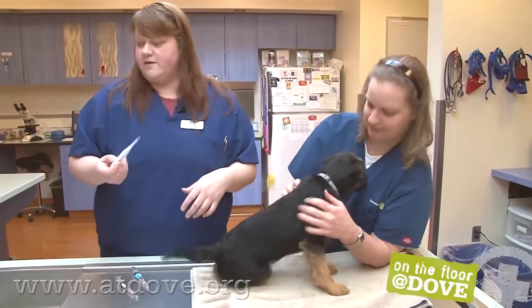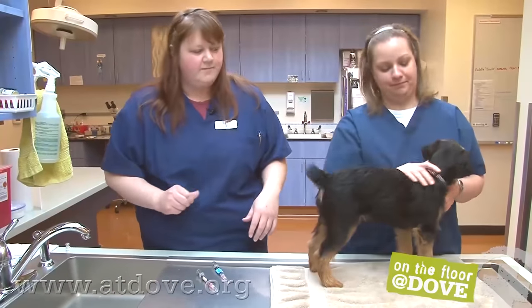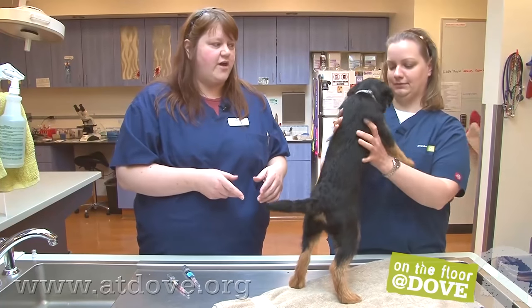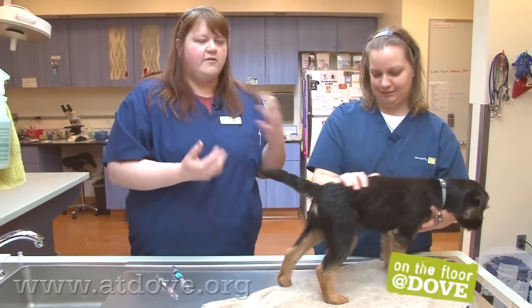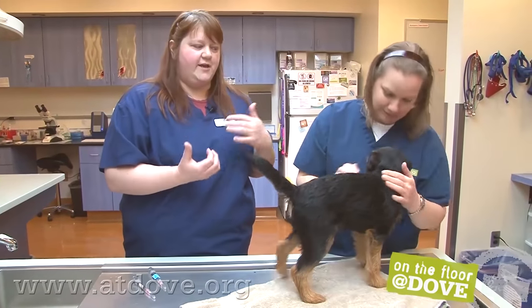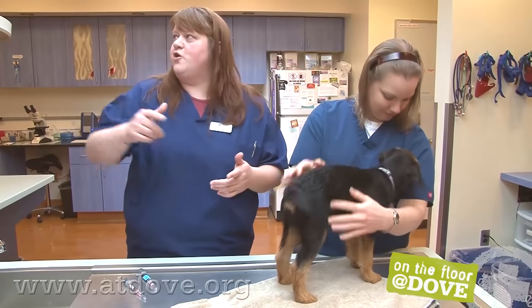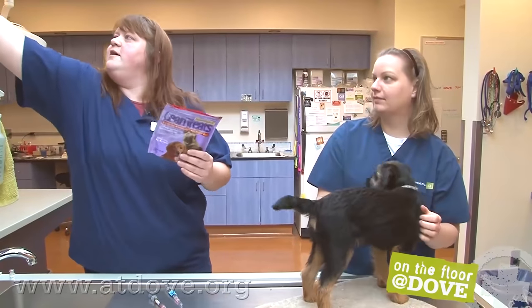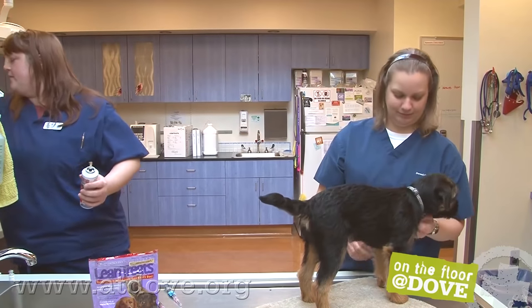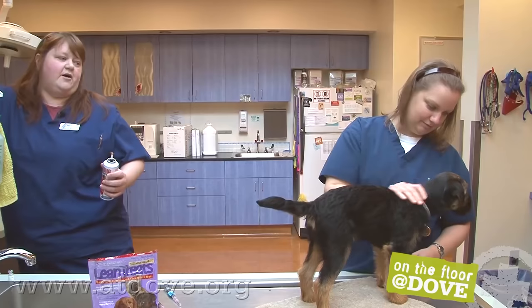Temp is 101.6, so we are done with that. With puppies, what we try to do is give them a food distraction or treat distraction, because every time they come in as a puppy they're getting poked, and we're trying not to make them associate us with bad things. So he's going to get a little bit of Kong paste on a tongue depressor, and hopefully that will distract him long enough.